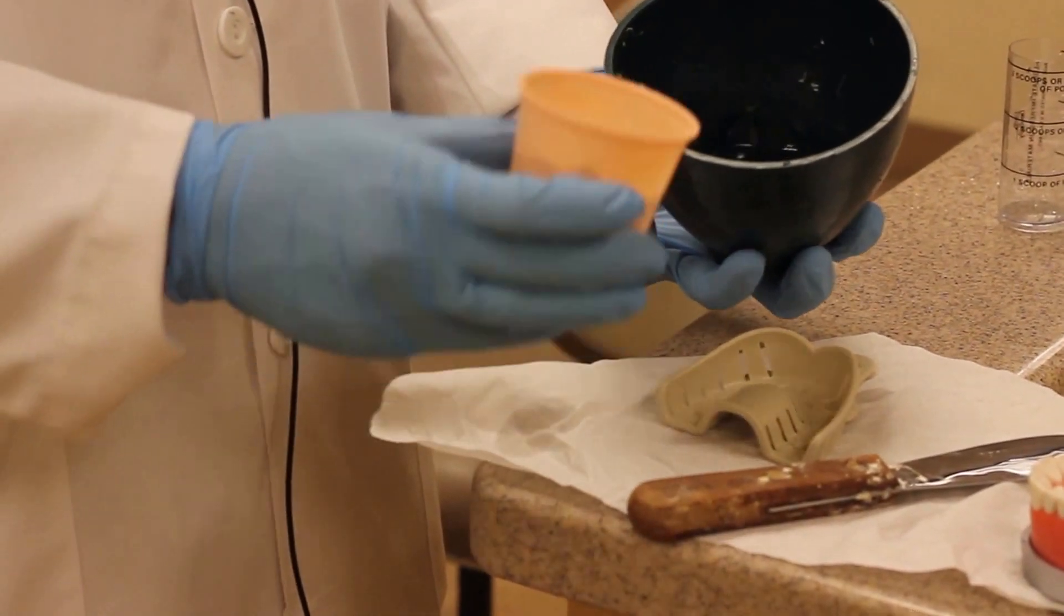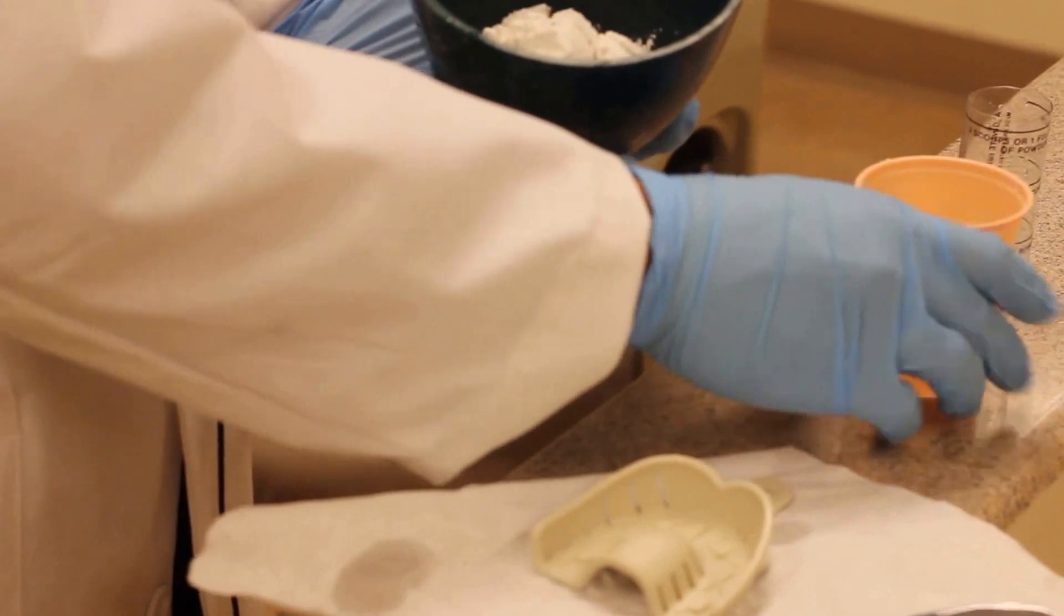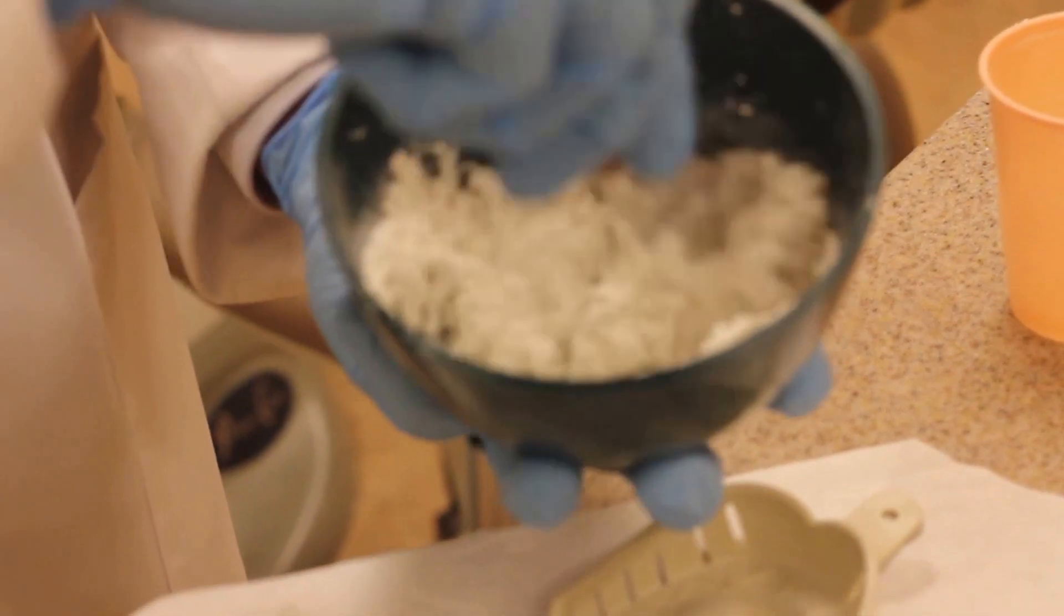Three scoops in a cup. You don't want to do it in reverse because it tends to clump a little bit more if you have the powder in first then you add the water.